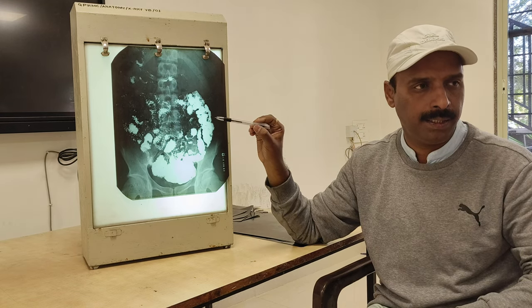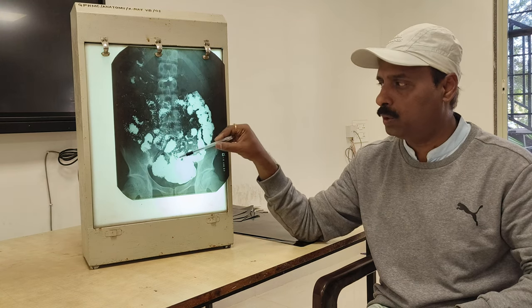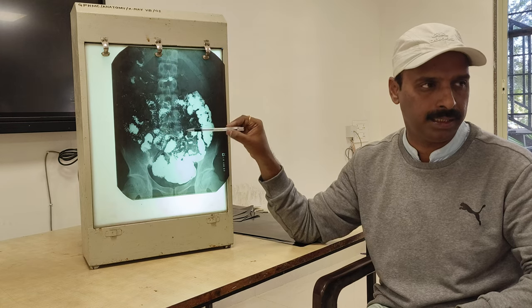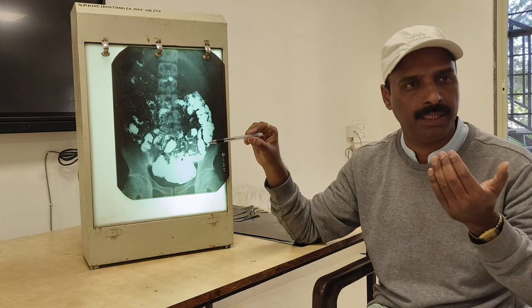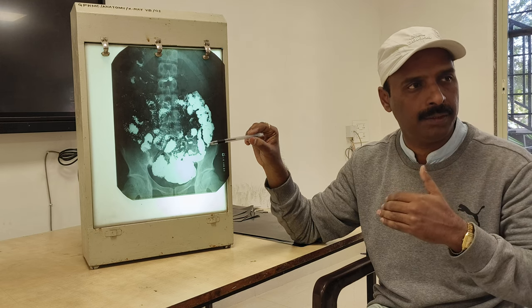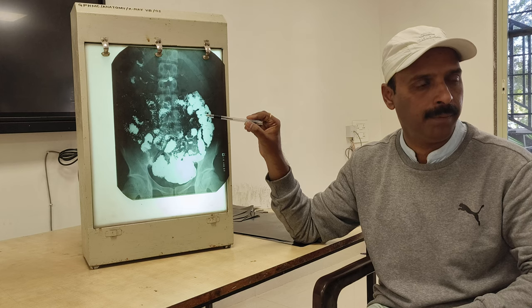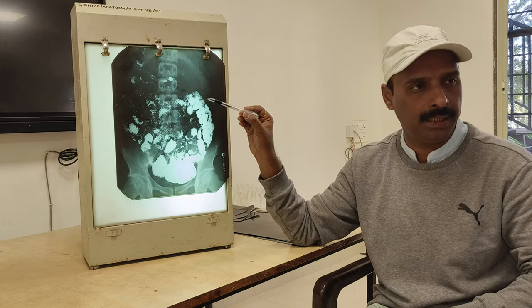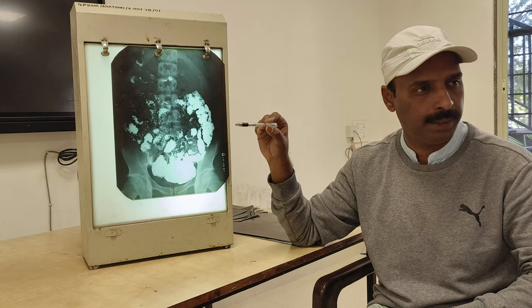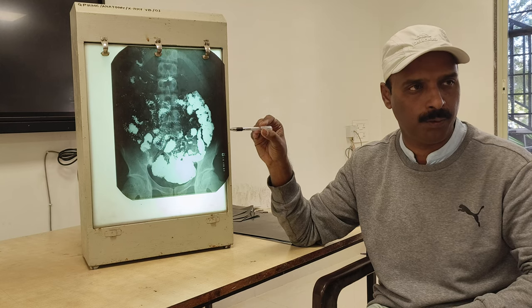Here also barium sulfate is used as a contrast media. You can see all the shadows of the large intestine. When we want to diagnose diseases of the large intestine, the distal part of the large intestine, we advise a barium enema. For the upper part of the GIT, like the esophagus, stomach, duodenum and small intestine, we advise the barium meal, barium follow through.